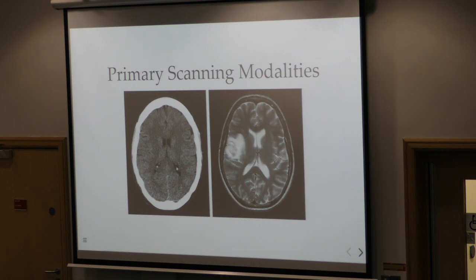And in addition to that, that's presuming the best case scenario where it looks like a normal version of that organ, as opposed to a grossly deformed version that could be the result of whatever accident a patient's undergone, because typically we're getting scans of patients, if they're in a hospital, there's something wrong. Don't come to us if you're perfectly healthy.